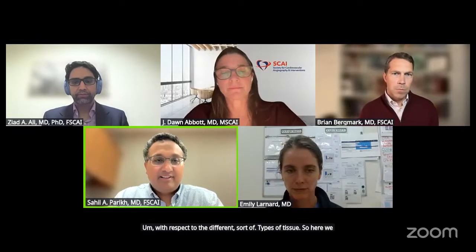All right, thank you. Let's talk about lesion preparation with respect to the different types of tissue. Here we saw diffuse proliferative neointimal hyperplasia. We've talked a little bit with hand waving arguments about should we cut it, score it, ablate it in some other way.